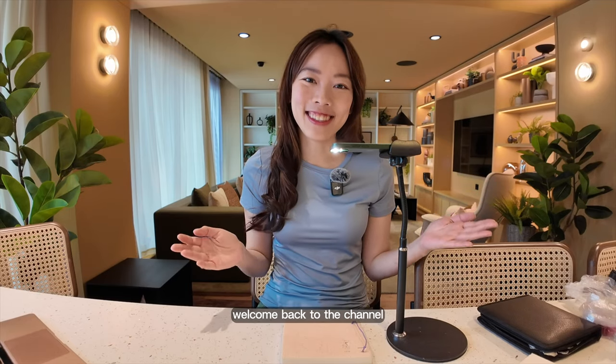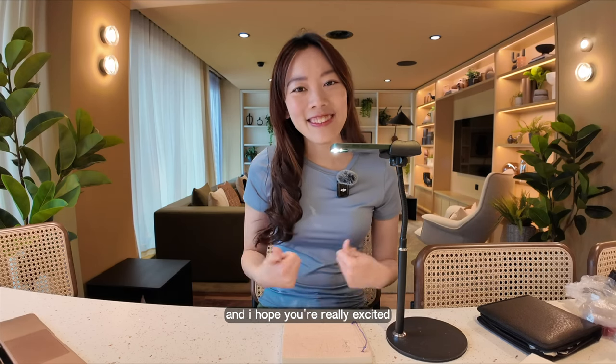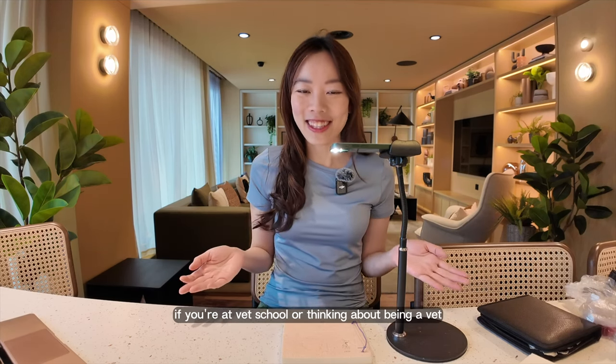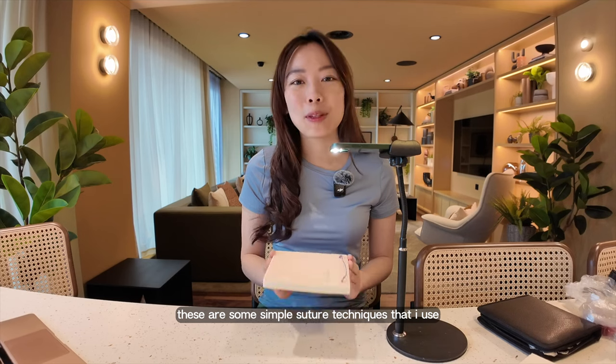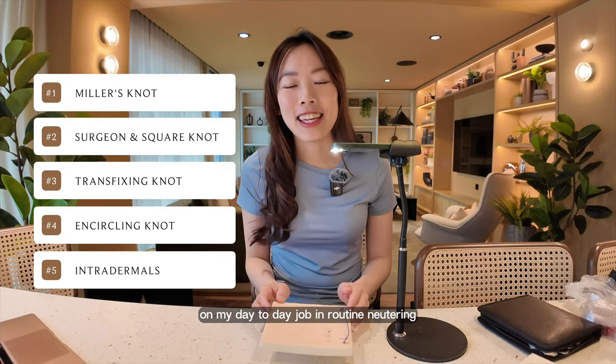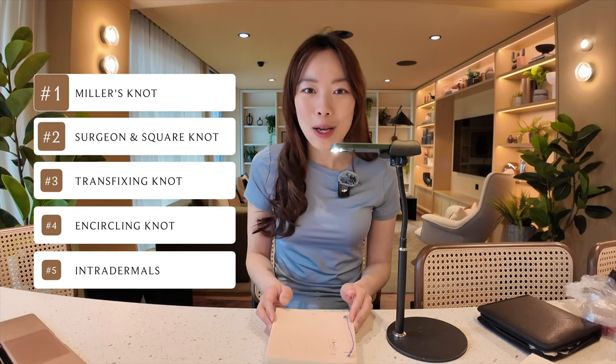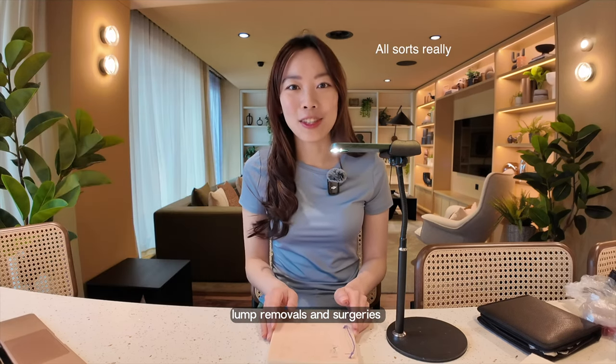Hey friends, it's Mei. Welcome back to the channel. Today we'll be doing some suturing together. I hope you're really excited. If you're at vet school or thinking about being a vet, these are some simple suture techniques that I use on my day-to-day job in routine neutering, dentistry, lump removals, surgeries basically.